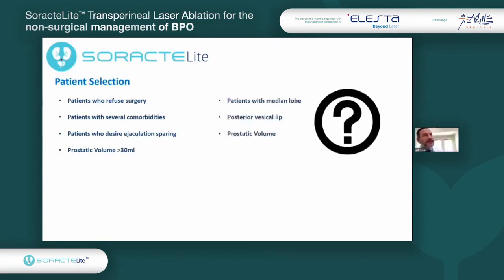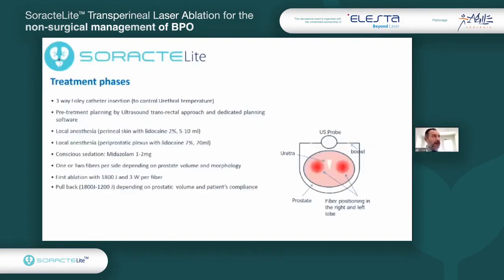And we are still investigating, in my experience, if and how we can treat patients with median lobe, or patients with a very large or hypertrophic posterior vesical lip. And also we are investigating which is the best prostatic volume to obtain the best results with the technique.